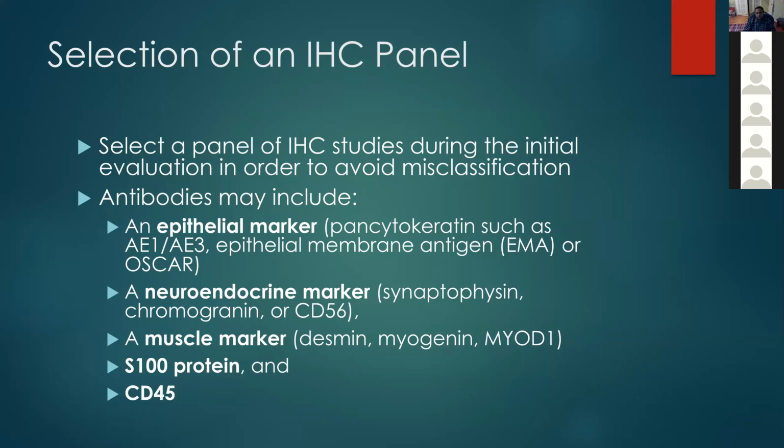We did not have immunohistochemistry before. 20 years ago, think about immunohistochemistry. We used to struggle to find these translocations and things like that. We have the same kind of issues now with gene fusions and their products. They are so specific for each tumor that they are routinely found in all of these tumors consistently. What I want you to remember is it's consistent. It is not like some of the rare lung cancers and things like that.